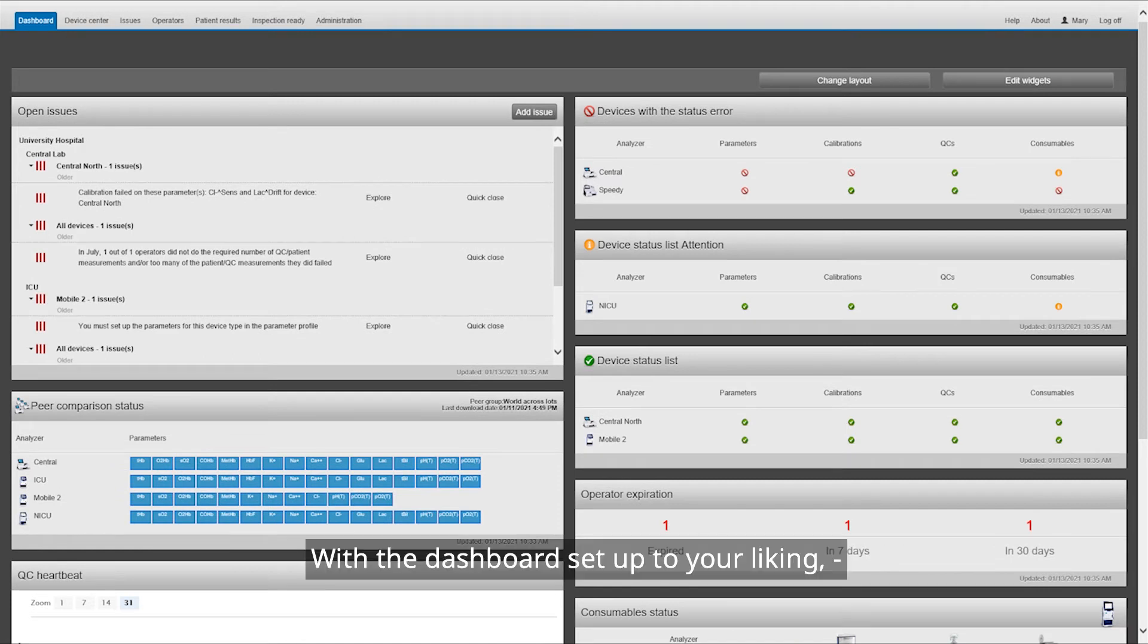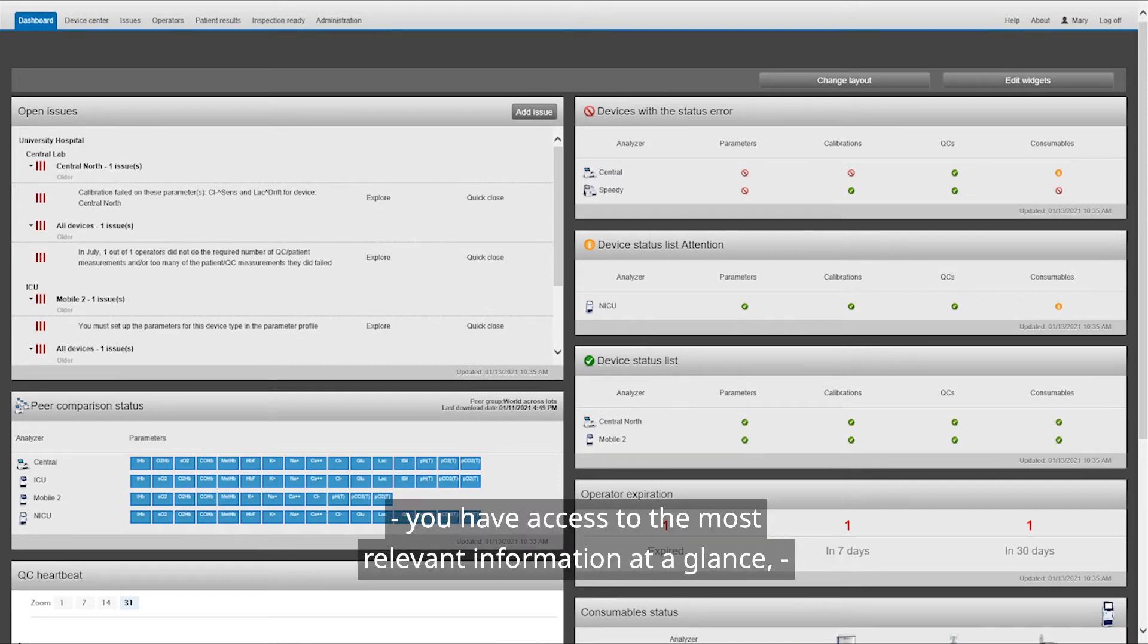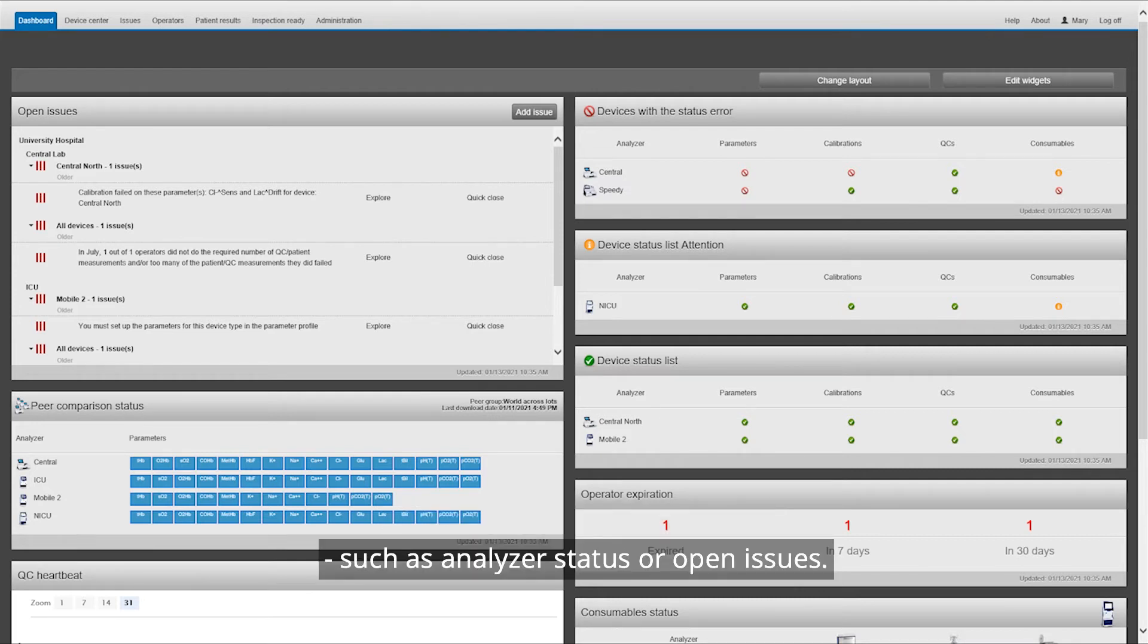With the dashboard set up to your liking, you have access to the most relevant information at a glance, such as analyzer status or open issues.